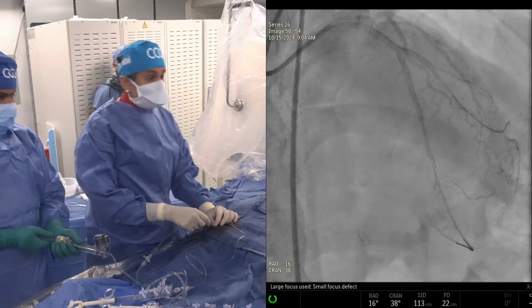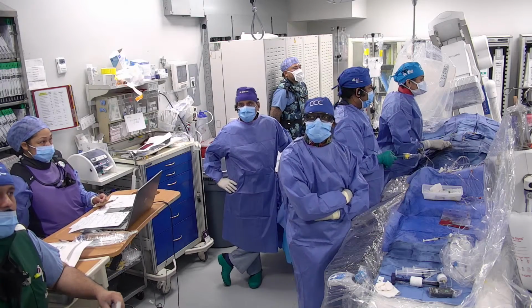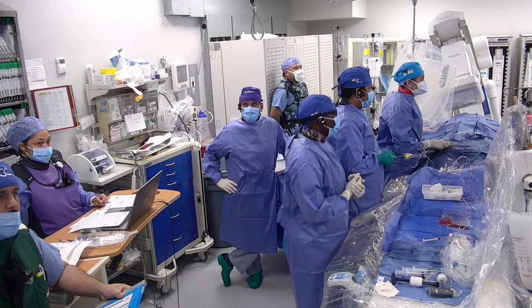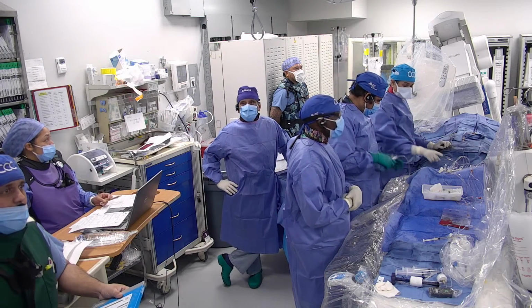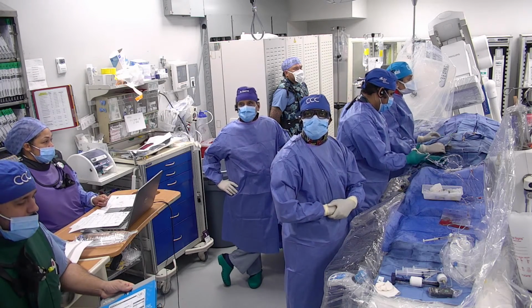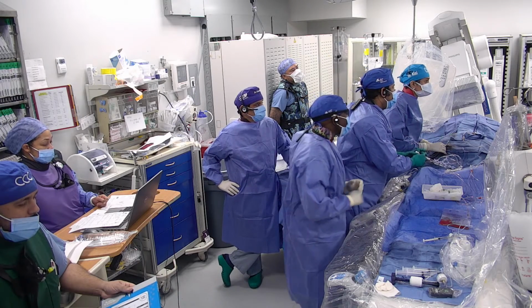Right. And there is a paper in JACC Intervention showing that once you have the myocardial bridge in the CTO, it is associated with an adverse prognosis. Which is not uncommon, and we encounter myocardial bridge in about 18% of cases, every 1 in 5, but that is associated with a higher restenosis in the future.